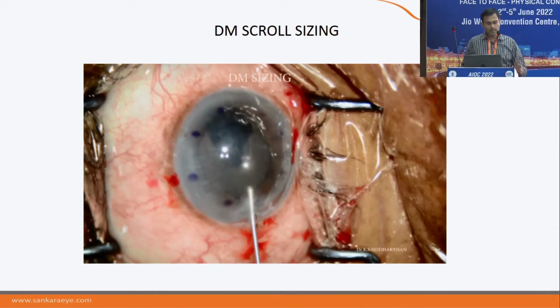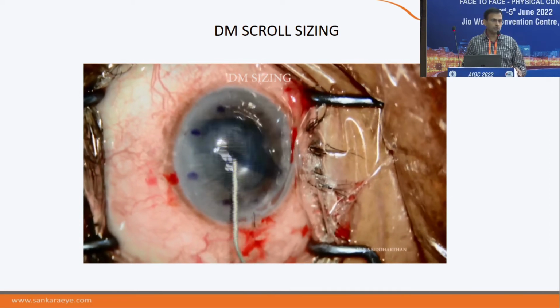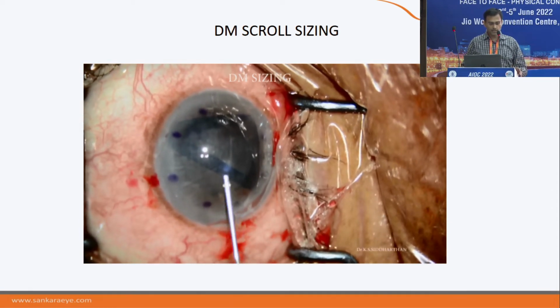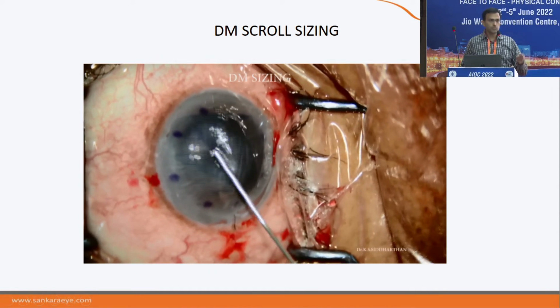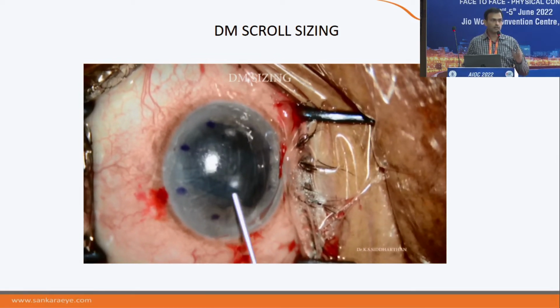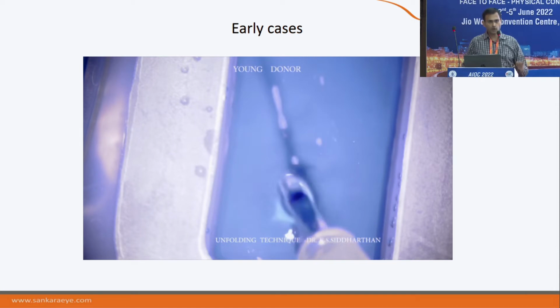Here is a case where you have almost a 6.5 mm pupil, and I am using a larger graft. When you have a larger pupil, try to use a larger graft. You can see that both the edges of the graft are sitting on the iris as a fulcrum, and it opens. So please size your graft according to your pupil size, and that is very, very important for your DM unscrolling.